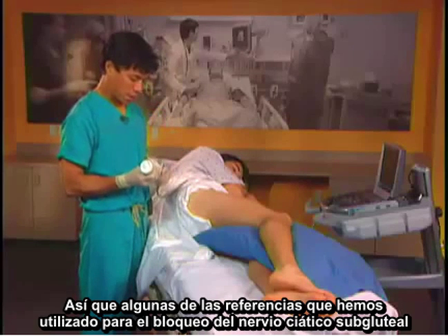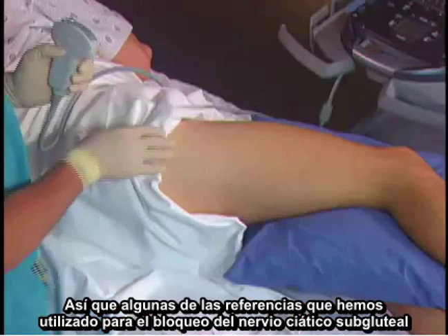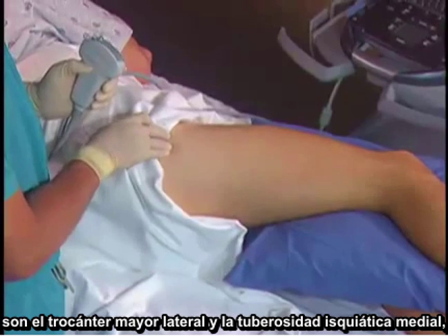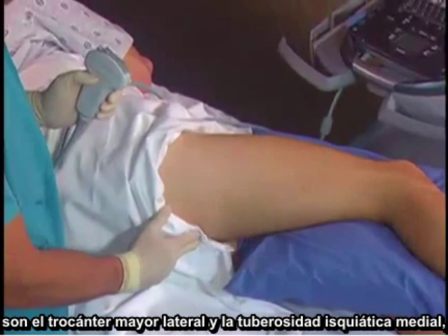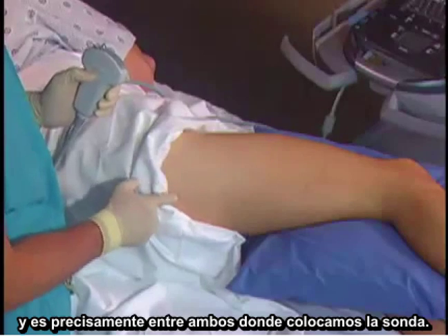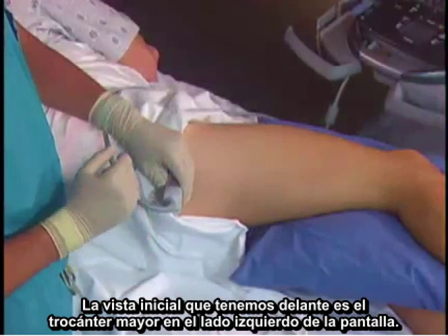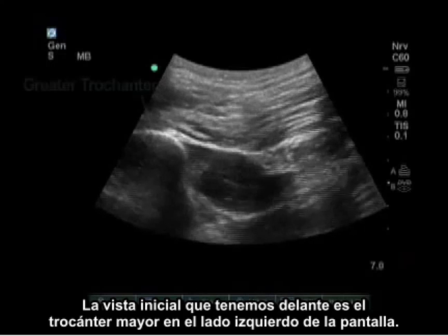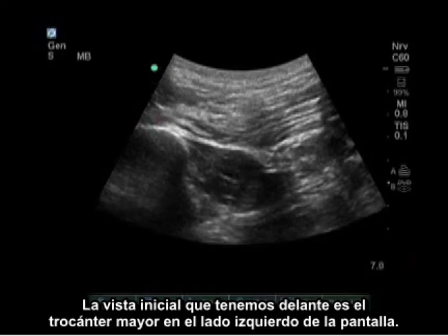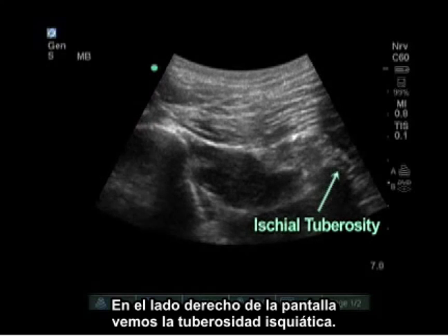Some of the landmarks we use for the subgluteal sciatic nerve block are the greater trochanter laterally and the ischial tuberosity medially. Directly in between these two is where we place the probe. The initial view shows the greater trochanter on the left side of the screen and the ischial tuberosity on the right side of the screen.